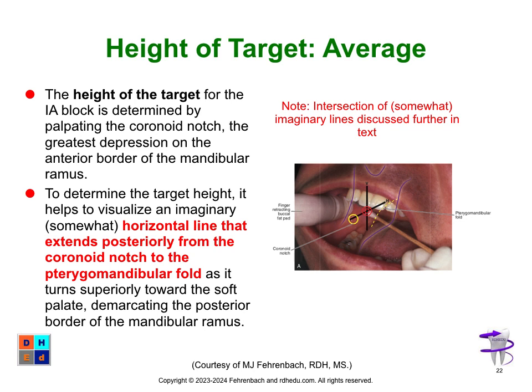To the reader's left there, what do we have? We have that again, that coronoid notch that we're palpating. I like this finger retraction. I like to use two fingers, not just one. Again, a finger on one side, thumb on the other. Look at the textbook for more information on that.